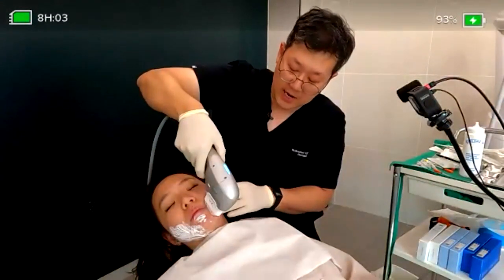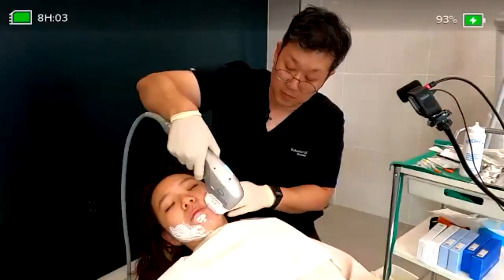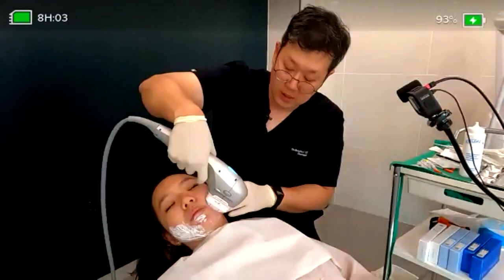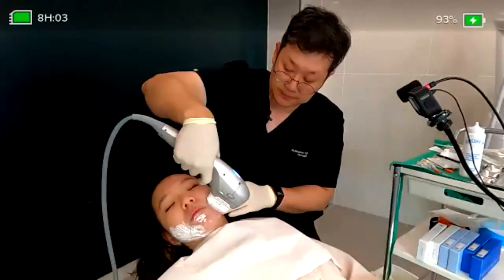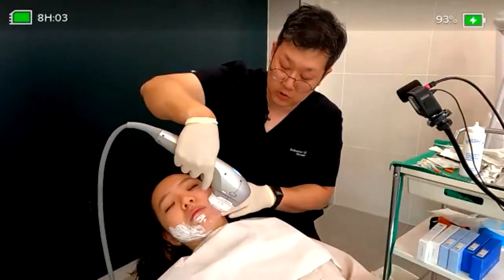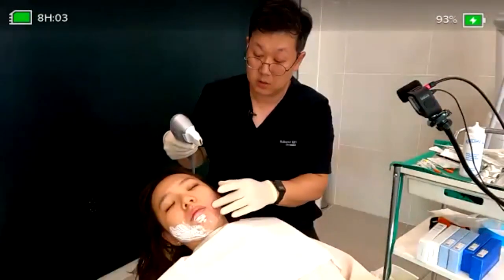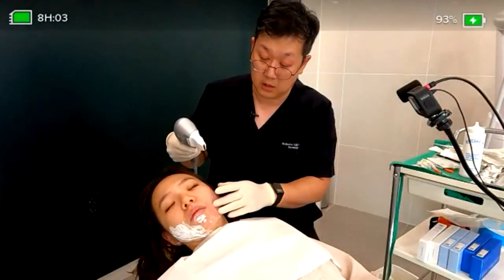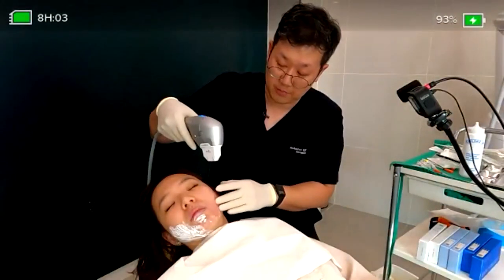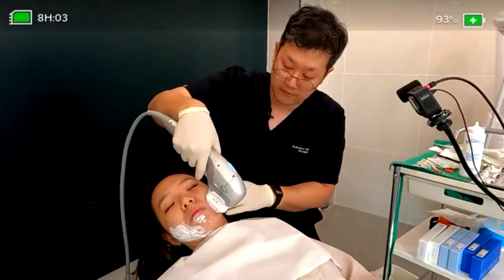Usually, I like the higher energies with a smaller number of passes for older or elderly patients, and the smaller energies with more passes for younger patients, because of the wrinkle depths and the wrinkle density and intensity. Maybe it can be a reasonable approach, but it depends on the skin condition of the face.